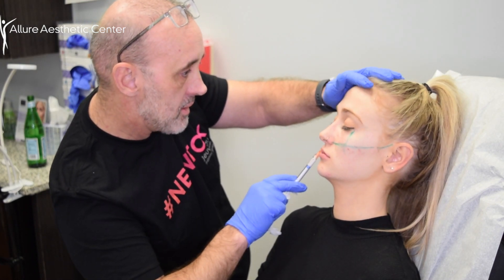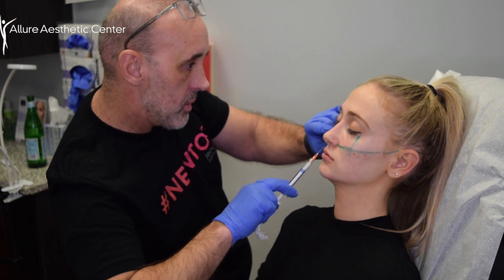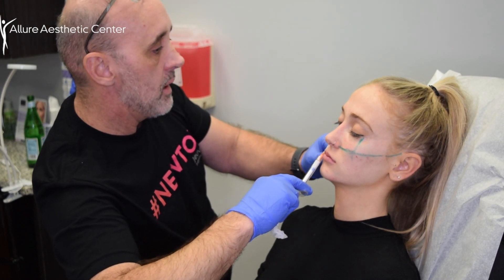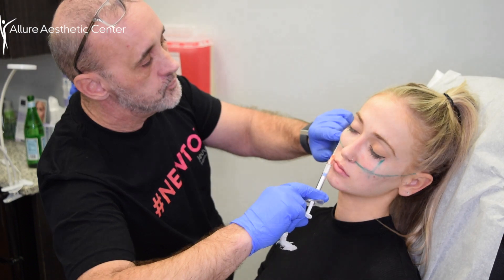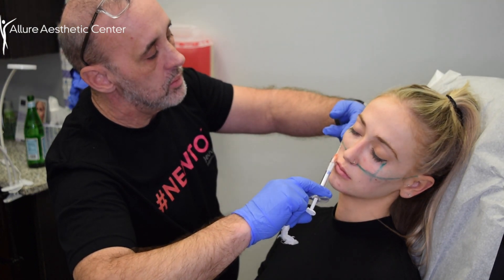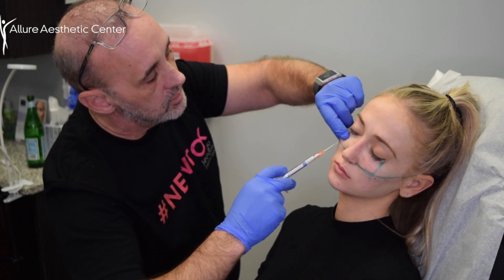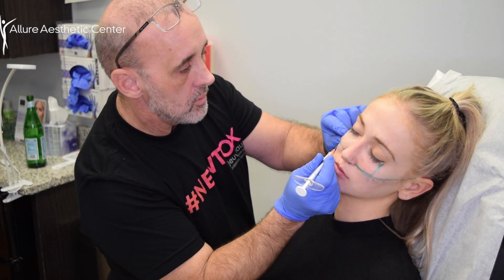Let me see you from the front — oh man, freaking awesome! So I used 0.5 here. Now we're going to go over to sector number two, which is right along Brittany's zygomatic arch, along the zygoma, just to kind of build up her cheekbone a little bit. So we're going to put volume right here, and you'll see the difference when we're done. We'll just go right along a little line here.